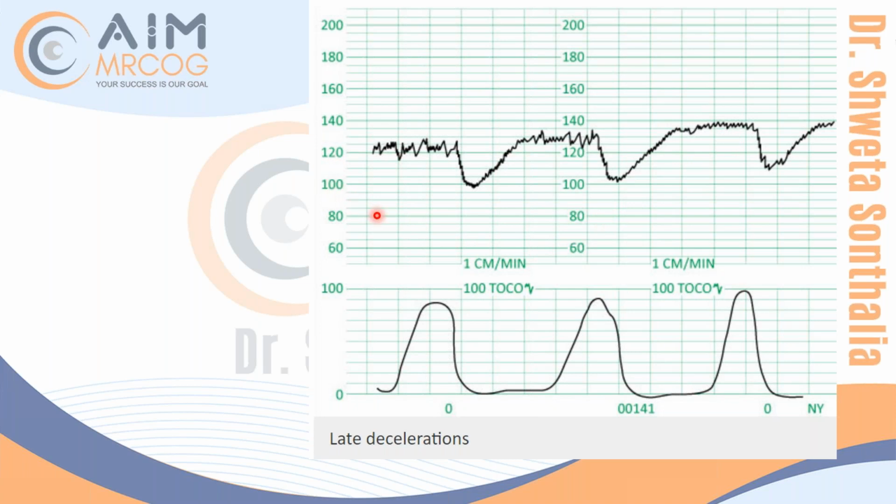Yes. Okay, and then variability. 5 minutes, 10 beats. Yes, very good. So variability here is approximately 10 beats, but as you see further, when your baseline is rising, the variability is decreasing as well, isn't it? Here it becomes just 5. Either it is filling the small box or it is even less than the small box. So here the variability is looking good, but here it is decreasing. Okay, next.